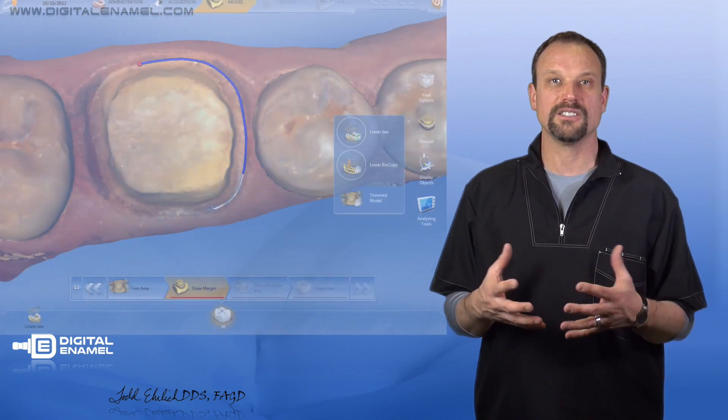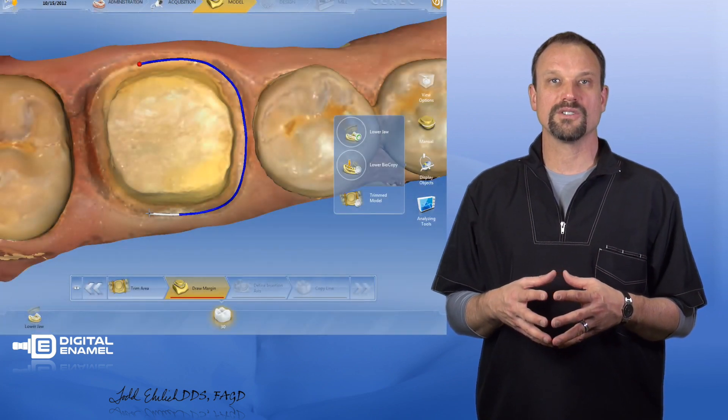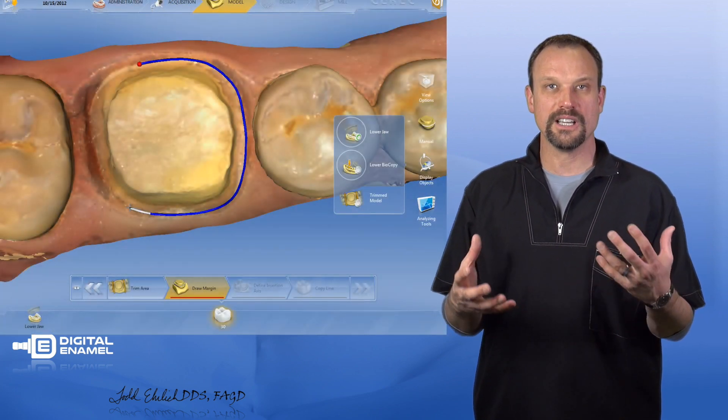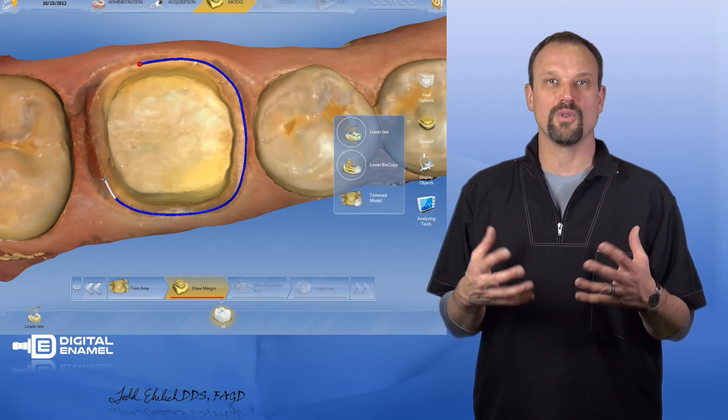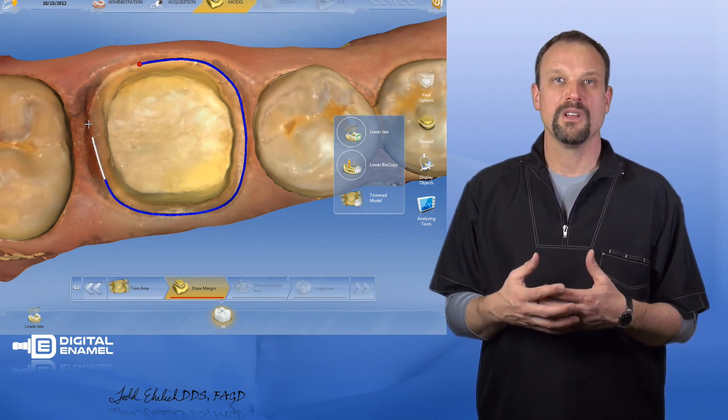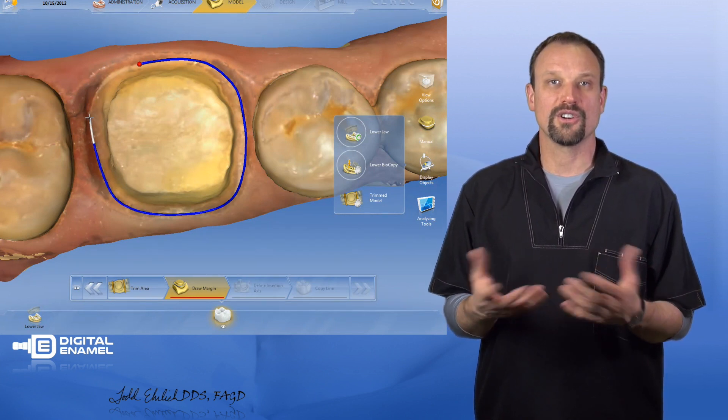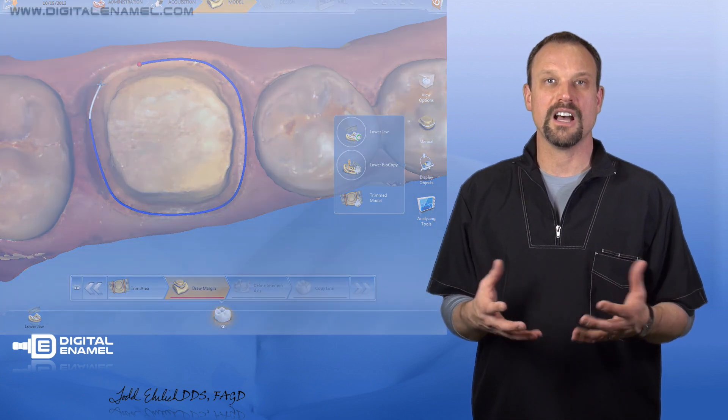But the next phase of CEREC is the model phase. This is where CEREC calculates the models and then you're going to do something to them. Basically, you're going to draw your margins and cut the dies if you need.